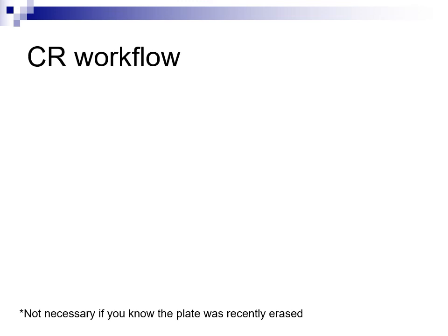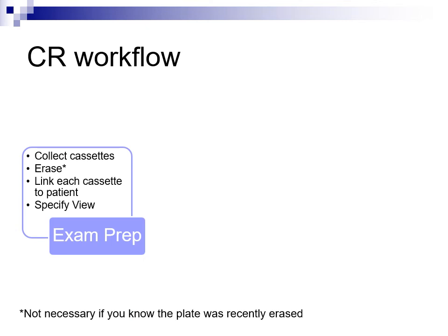Probably the biggest problem attached to CR technology is the workflow during the examination. If you're migrating from film screen technology, you will find the workflow very similar to CR. To prepare for an exam, collect the cassettes needed, one view per cassette, and erase them if necessary. At this point, you may want to mark each cassette with patient information and which view the cassette will hold.